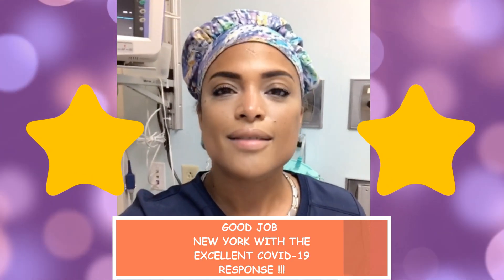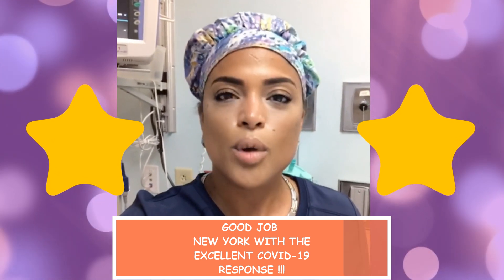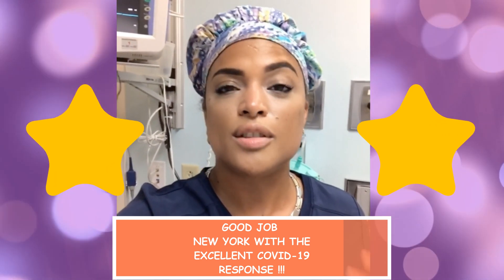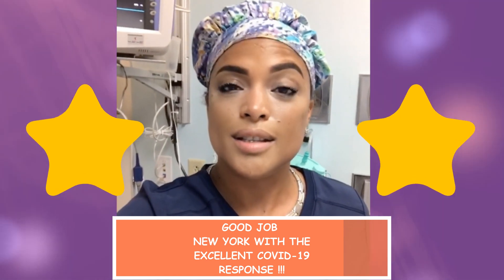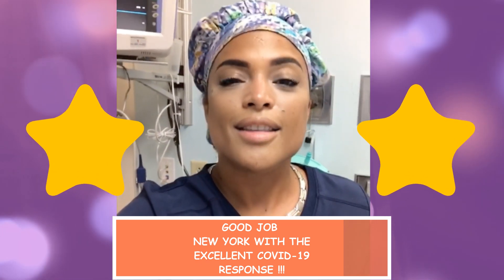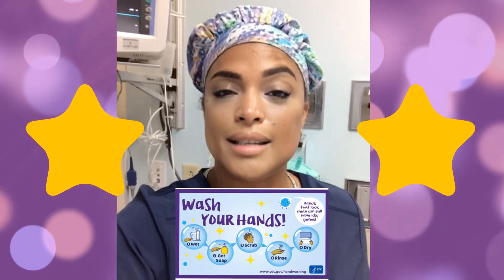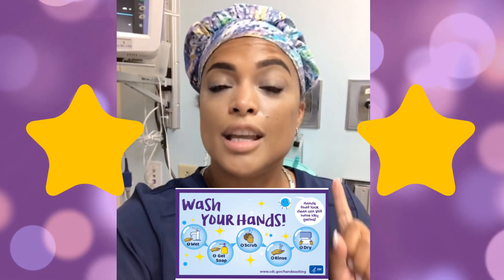Now for those questions I've been receiving — "If I wear a mask, is that going to have an effect on the amount of oxygen concentration in my body?" As you can see from my assistant Evelyn, she wore the mask and also took it off and got a pulse ox reading of 99 to 100% both times.